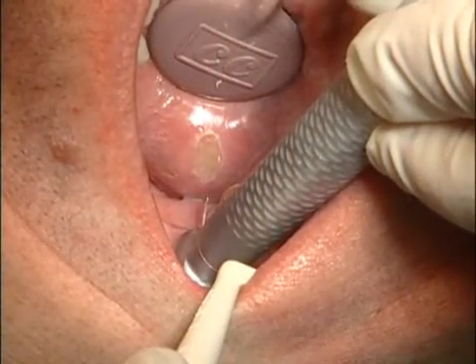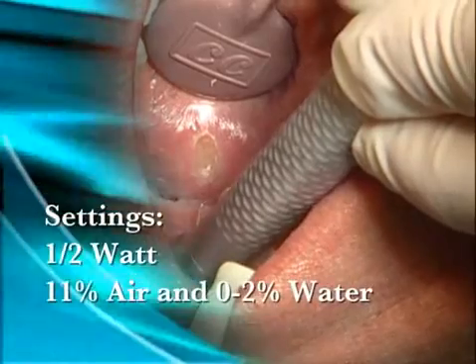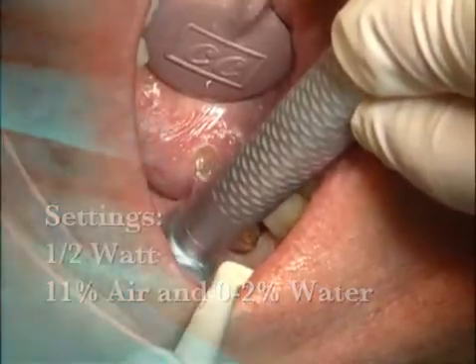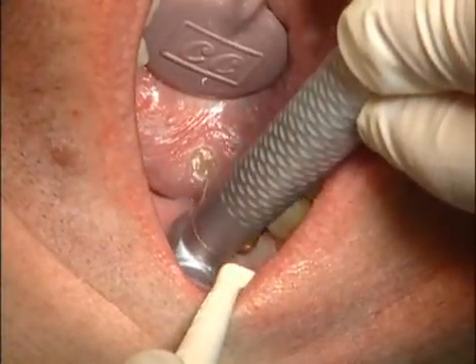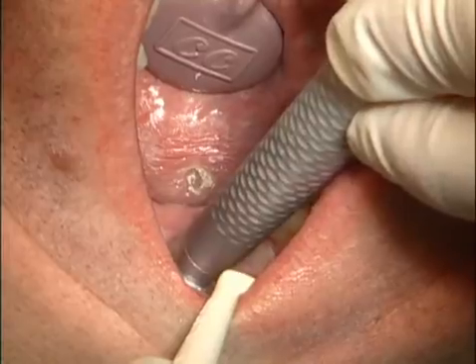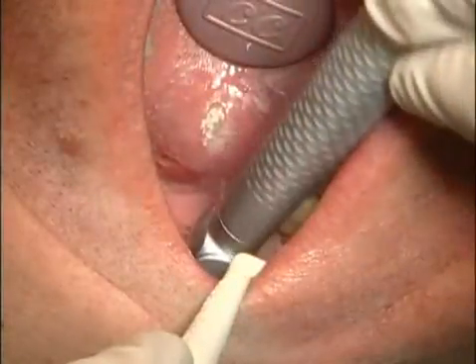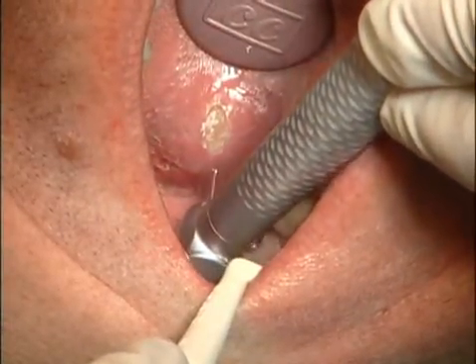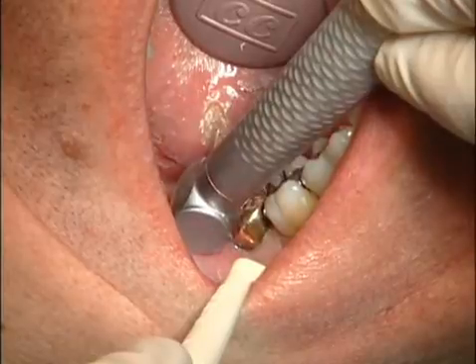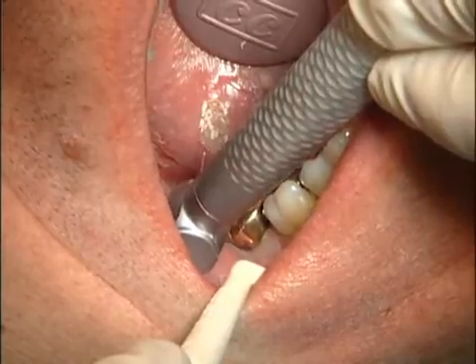Canker sores and aphthous ulcers, we want to treat them at a half a watt with 11% air and no water. You approach the canker sore or the aphthous until the surface paints white. The best way to do it is to outline it and then paint it in. You can expect the discomfort to be gone from the patient in less than 60 seconds and the lesion to be out of their mouth in 3 days. And in that period of time, no discomfort.